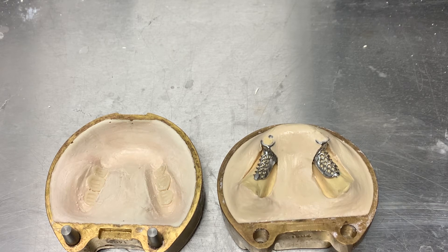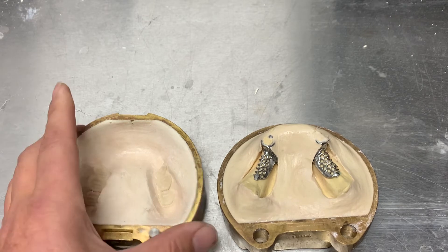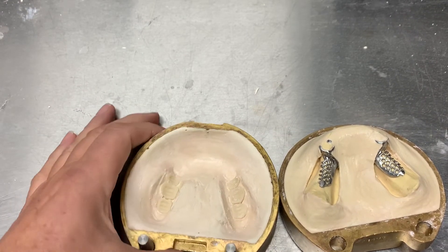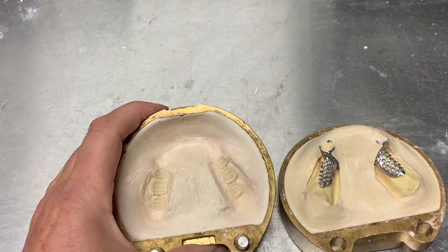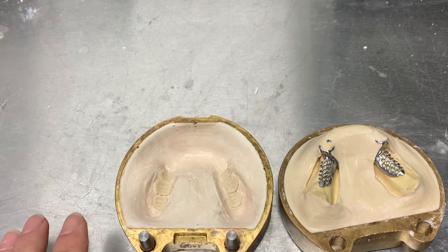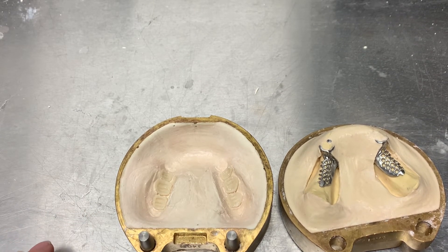I'd hate to get that white filmy process on the denture from excess separator. Over here on the other side, I've ground in some grooves on the teeth and taken the separator off the teeth, since I did get some on. That also lets me see if the teeth are secure in the stone. If they're not, I'll use a small amount of cyanoacrylate — crazy glue — and glue them into place. In this case, nothing came apart.